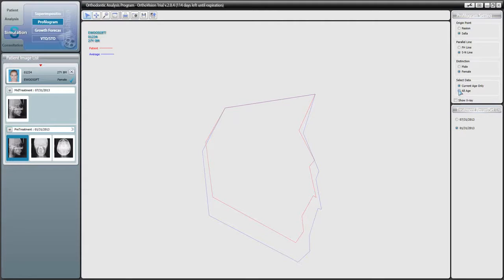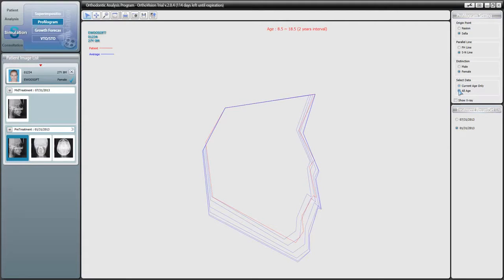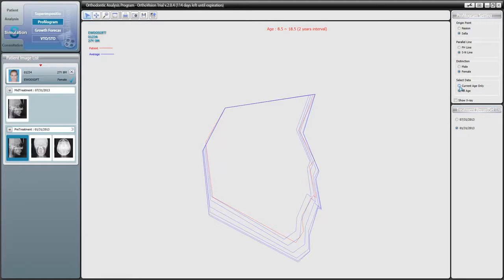The last particular setting is an option to show all age averages. When this is selected, OrthoVision displays an age range at the top, followed by the average profilograms of each particular age in two-year intervals.